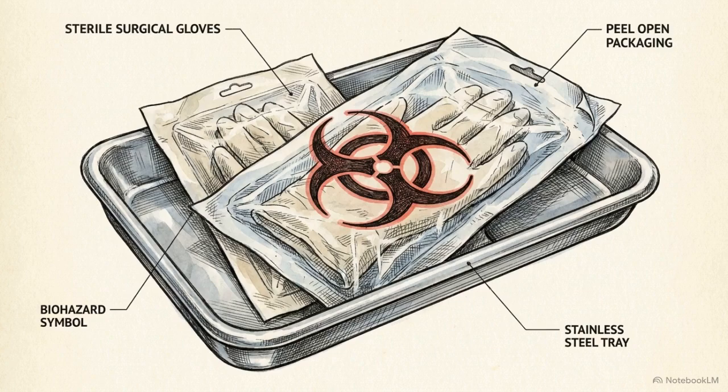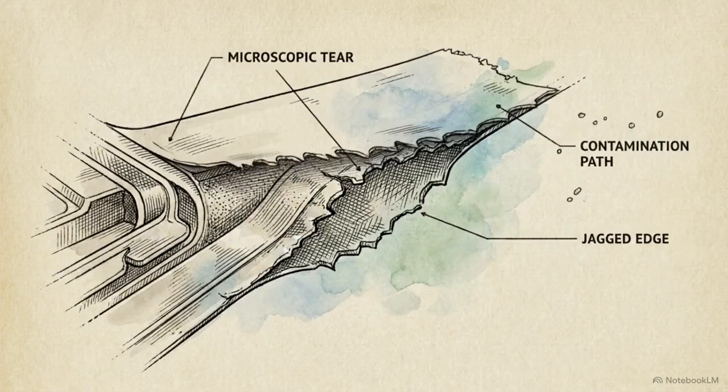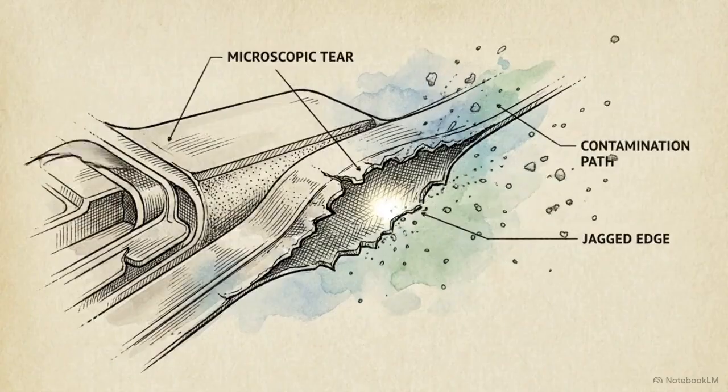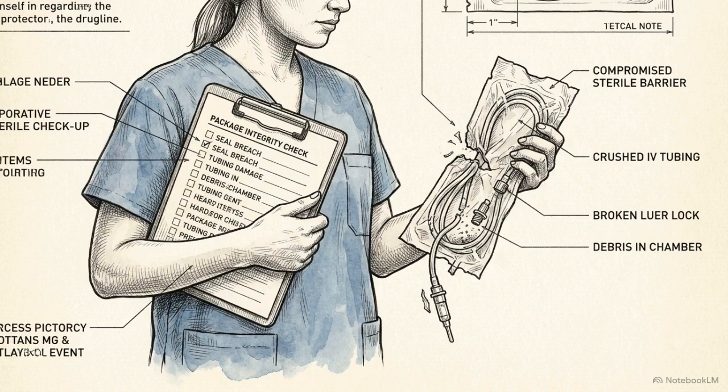The item is officially unsafe for clinical use. Similarly, physical damage to a sterile package compromises its integrity, exposing the interior to pathogens. Even if the item is months away from expiration, a compromised barrier renders the device a severe infection risk. Upon identifying an expired or damaged item, clinical staff must execute an immediate protocol.